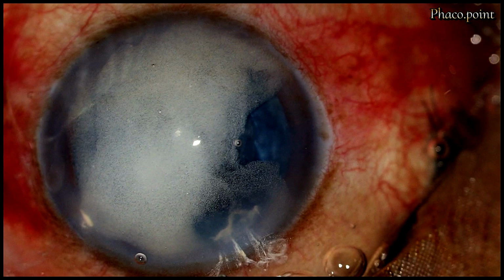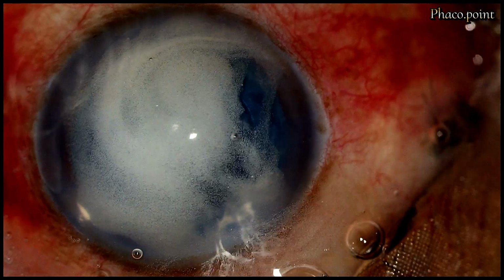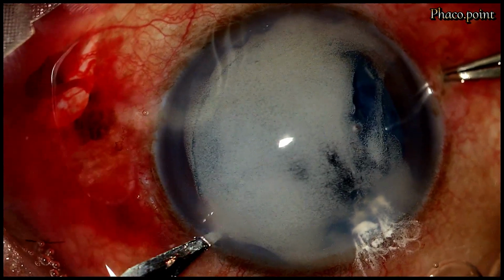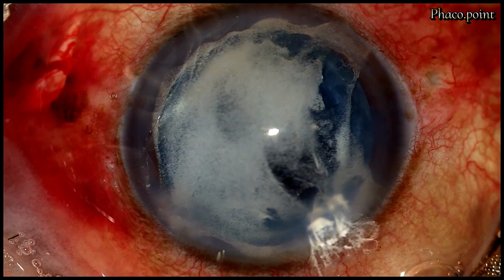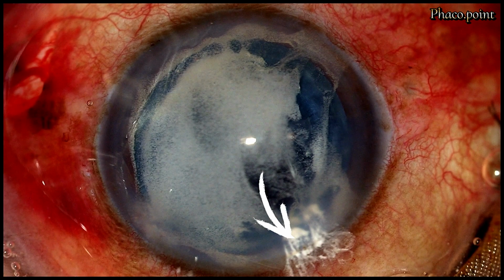And in a few moments after injecting the triamcinolone in the anterior chamber, it is then washed out. Upon washing out the triamcinolone, as you can see, it's clearly obvious that there is a significant disturbance of vitreous in the anterior chamber. The stained vitreous can also be seen prolapsing through the main incision.